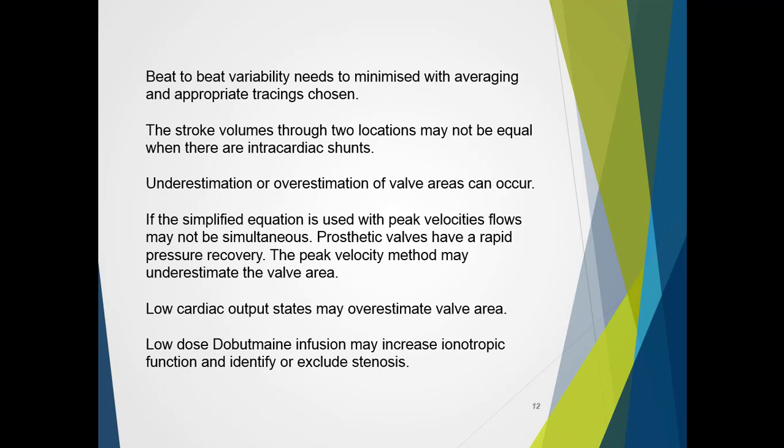Determining whether aortic valve stenosis is significant and warrants patient management is challenging when there is also severe LV systolic dysfunction. A patient may require a dobutamine infusion at low doses to stimulate an inotropic response or increase contractility. When the patient does not have significant stenosis, the sonographer will observe a larger increase in the LVOT velocity over that through the aortic valve. A recalculation of the valve area will show an increase. In the presence of severe aortic stenosis, the VTI will increase proportionally for both, and thus not really affect the calculation for valve area.